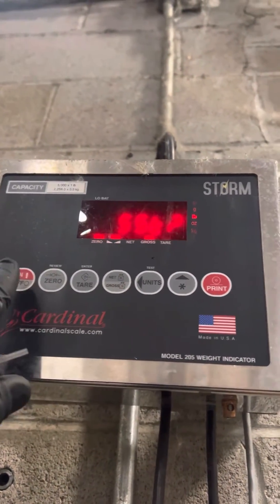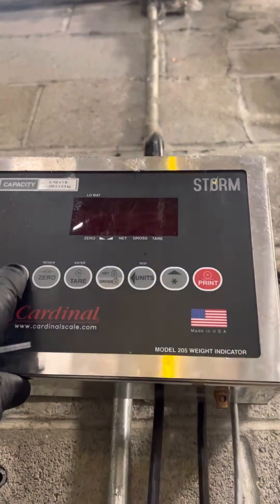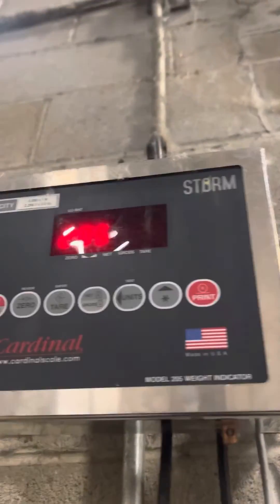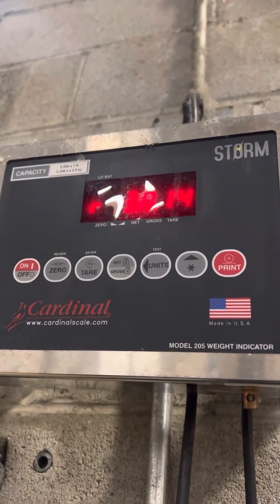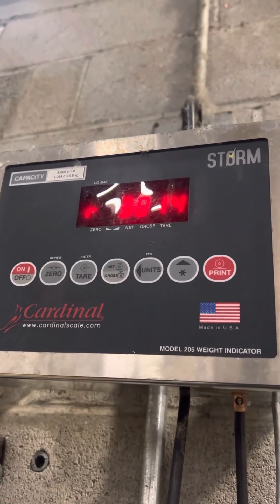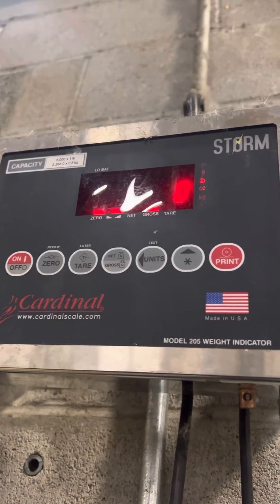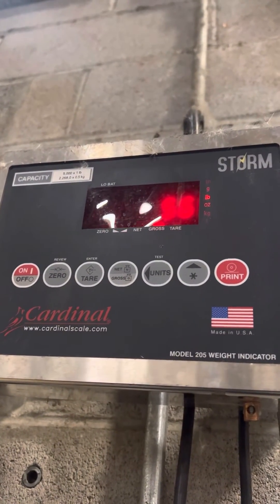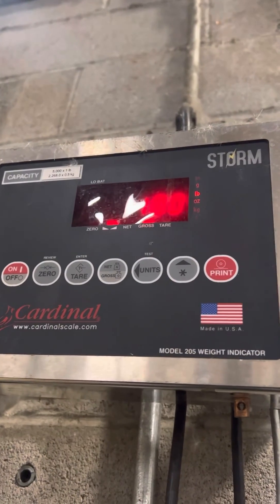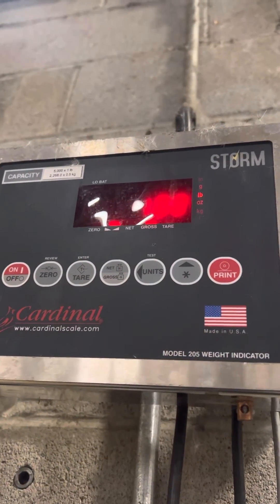At this point, all you've got to do is turn it off and turn it back on. And that's how you adjust the calibration of a Cardinal 205.